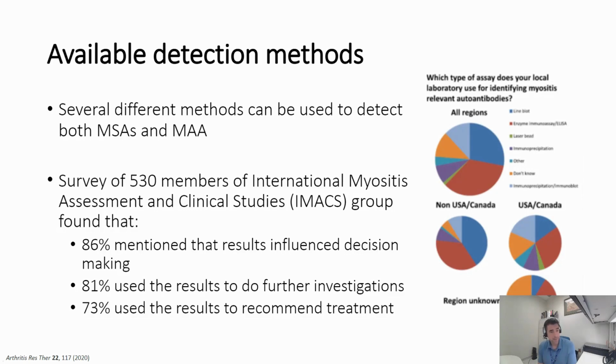So the salient feature here of the survey is that the results of myositis-specific autoantibody testing, or even myositis-associated autoantibody testing, do have a clinical impact. And so understanding the methodologies will give us an understanding of the advantages and disadvantages, which we can then communicate to the physicians when supporting their clinical decisions when they have these types of patients.